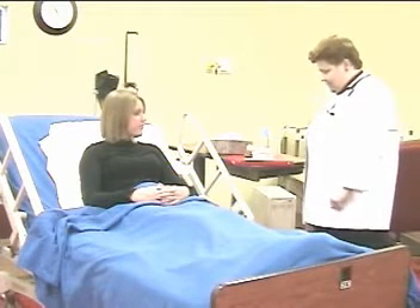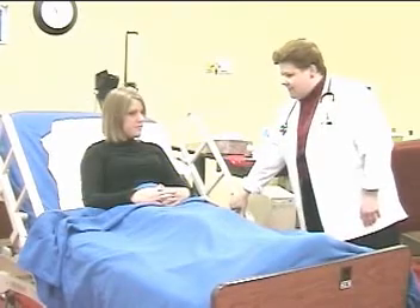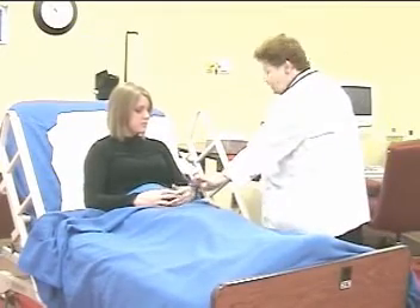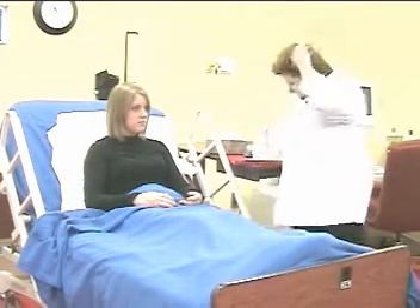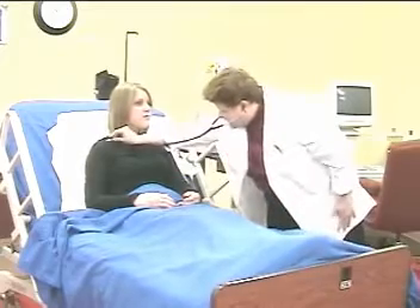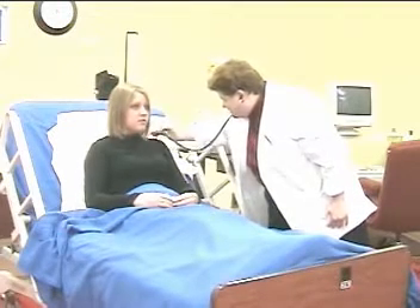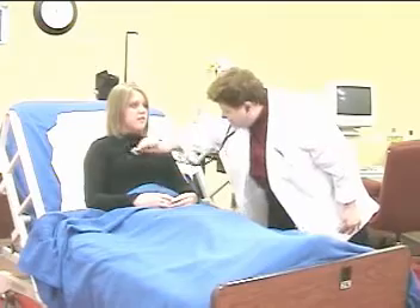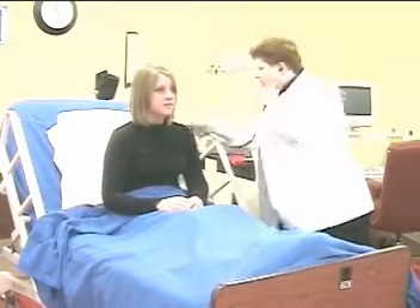Monitors heart rate, respiratory rate, and breath sounds. Before we begin, let me just put your head up a little bit to help you take some nice deep breaths in. Repositions patient if necessary. Can I just touch you and take your pulse? Counting her respiratory rate. Can I please listen to your breath sounds? Can you just take some nice deep breaths in and out for me? Can I have you lean forward a little bit? Thank you.